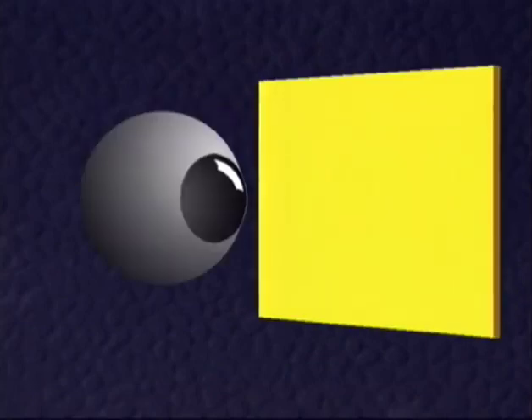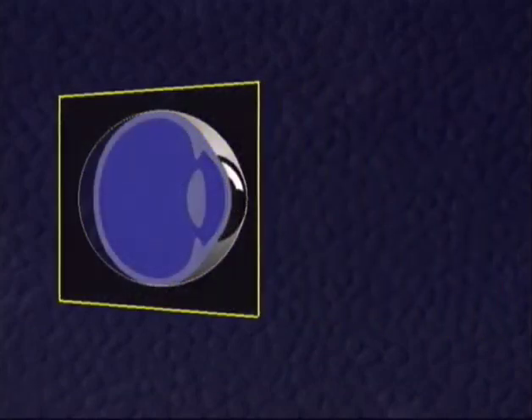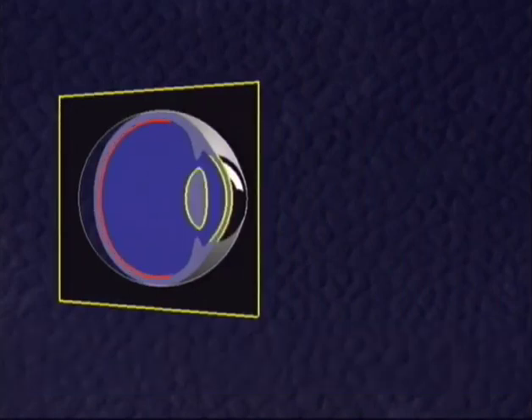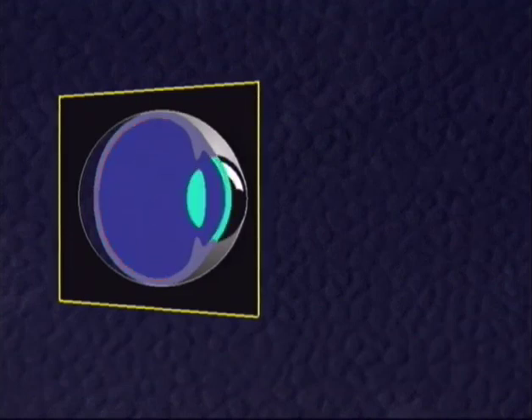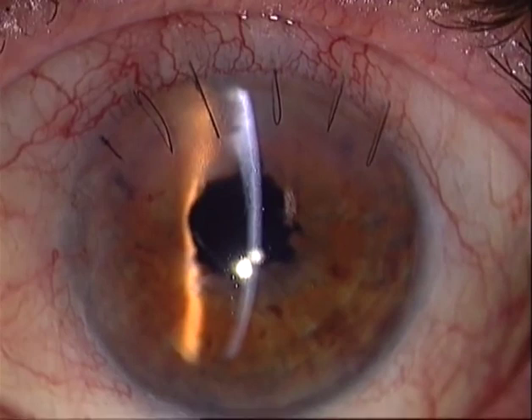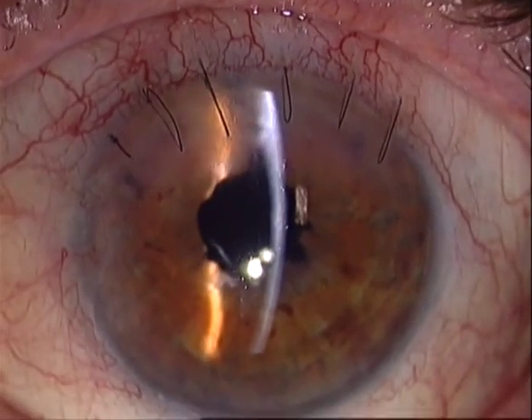Actually, the extremely narrow slit light acts as an optical knife, which can provide an optical section through the eye. What is the purpose of the optical knife? The optical knife reveals the exact outlines of tissue as well as their phenomena in their inner structure with high precision. For example, in the cornea, the optical section can serve for quality control of corneal surgery.